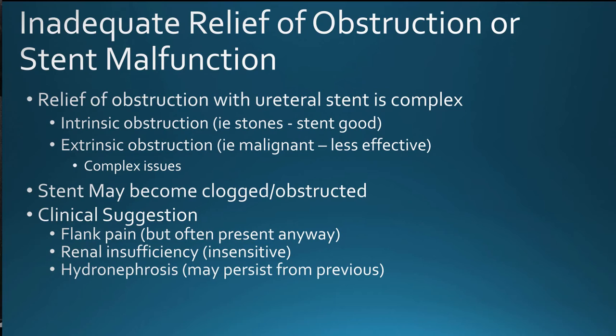This is a complex component of stent issues, and that's whether the stent is actually functioning or is occluded and not functioning.